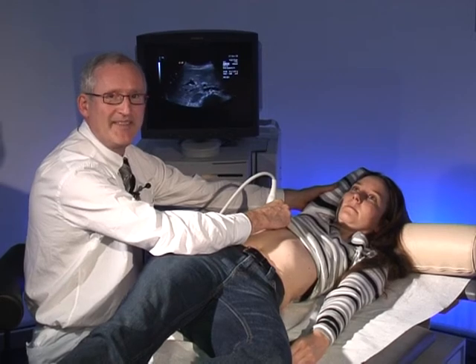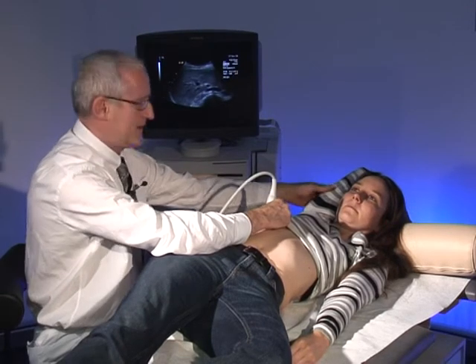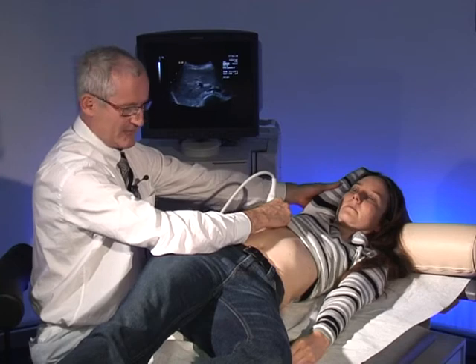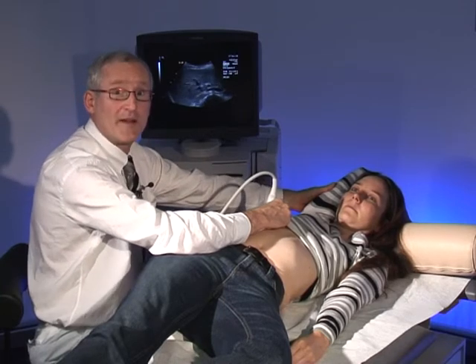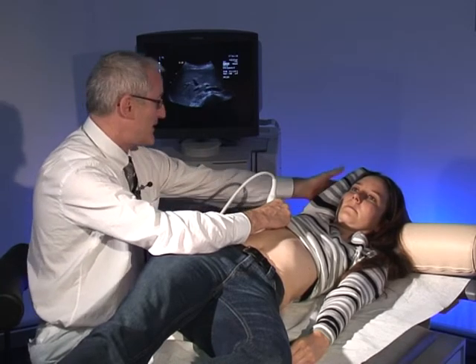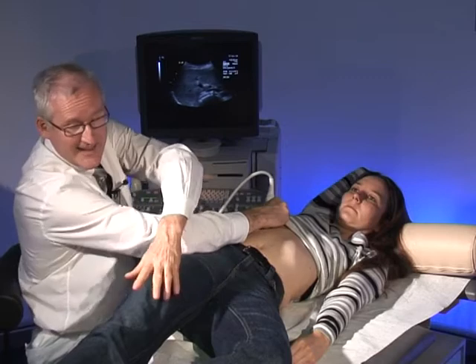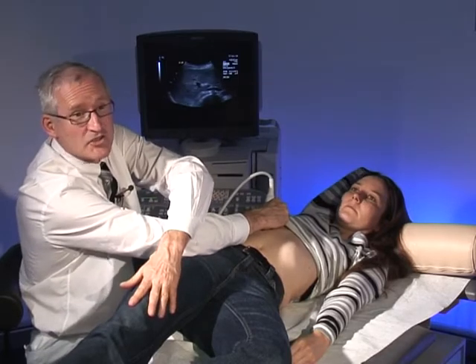While examining the right adrenal gland, one has to position the patient in the left lateral position we have described before, with the right arm above her head and the leg stretched.